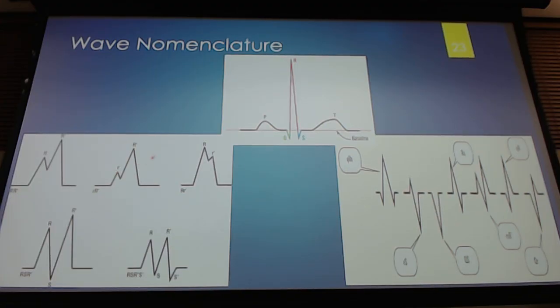Now again, sometimes you'll have a capital R, sometimes you'll have a lowercase. Lowercase r just means it's a little r. Okay, capital means it's a big R. That's all the differences. I don't really care, you don't need to know that, because a lot of books don't use the differentiation, but Garcia does differentiate that way. We've got another big R and then little r. Again, the little r here, that's a lowercase r, and then a prominent R is the uppercase.